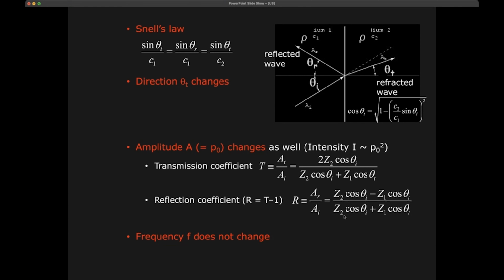And so now we can already understand why, as I said before, ultrasound cannot penetrate through the shell of an egg. Of course, if we take an ultrasound transducer and put it on the shell of the egg, we first have the transducer, then we go from the transducer to air. Even if there's a very, very small air layer between the transducer and the egg, we go from the transducer to air, then from air to the calcium of the shell, and then from the calcium again to the soft tissue of the egg. Because these acoustic properties are so different, we have no transmission. Everything is just being reflected and we can't see anything.